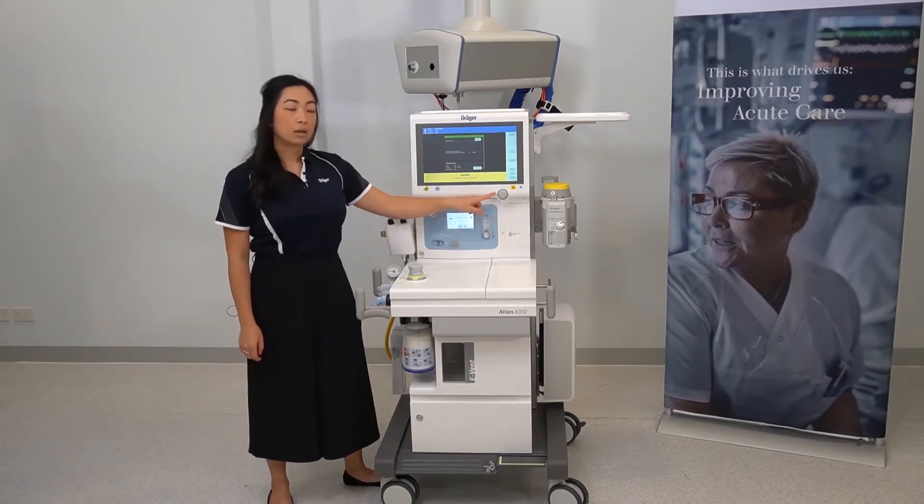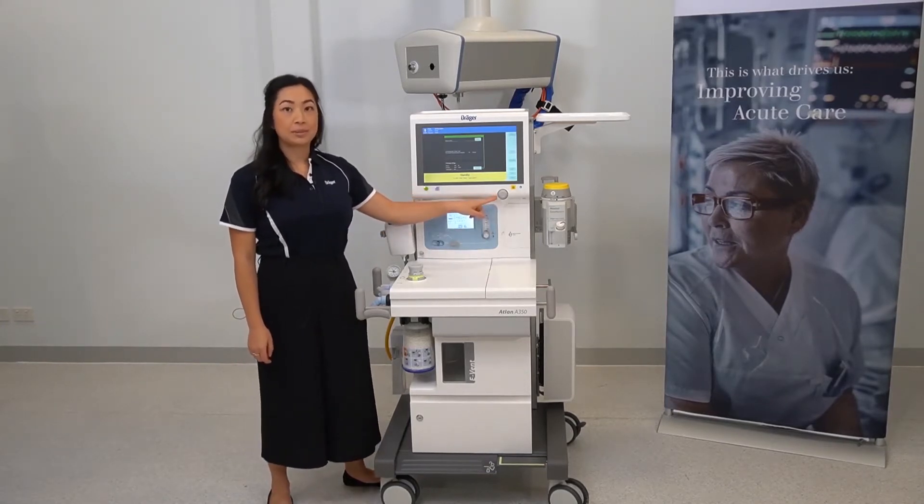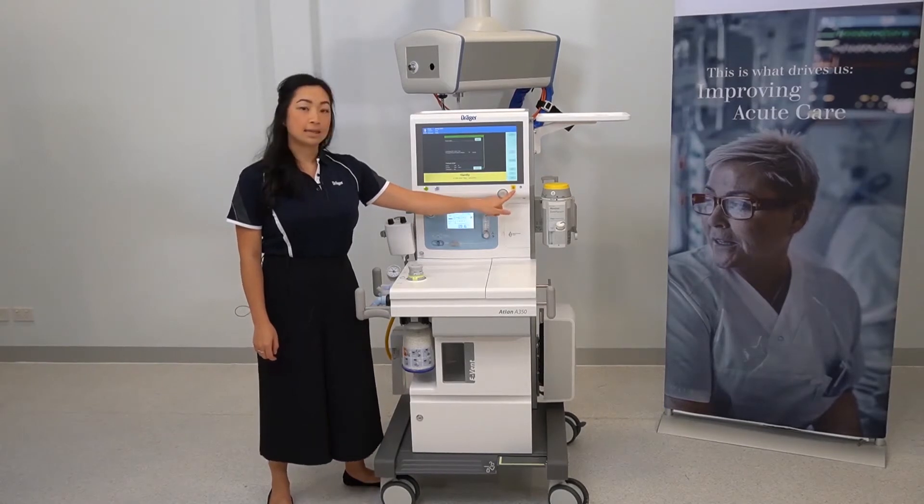These are the rotary knobs for making and confirming selections, and the alarm silence key.